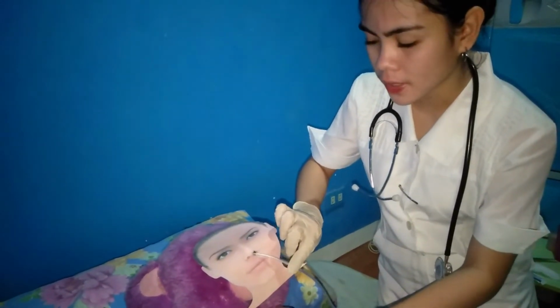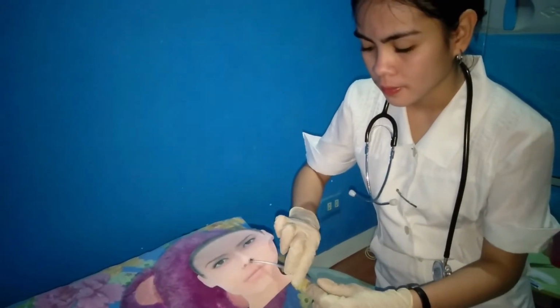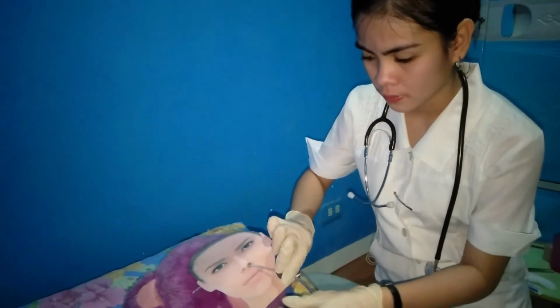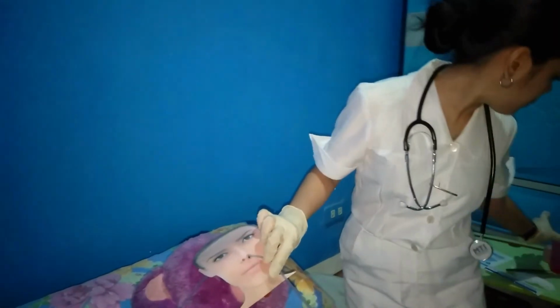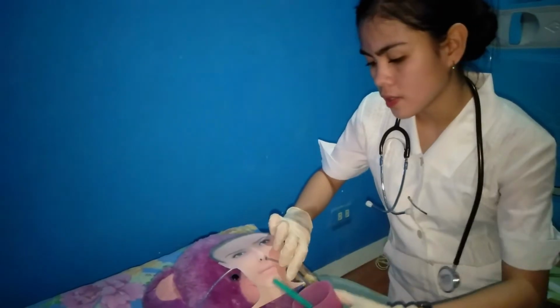Once the tube reaches the oropharynx, the client may gag and retch. We may need to ask the client to tilt his head forward and encourage him to drink and swallow.